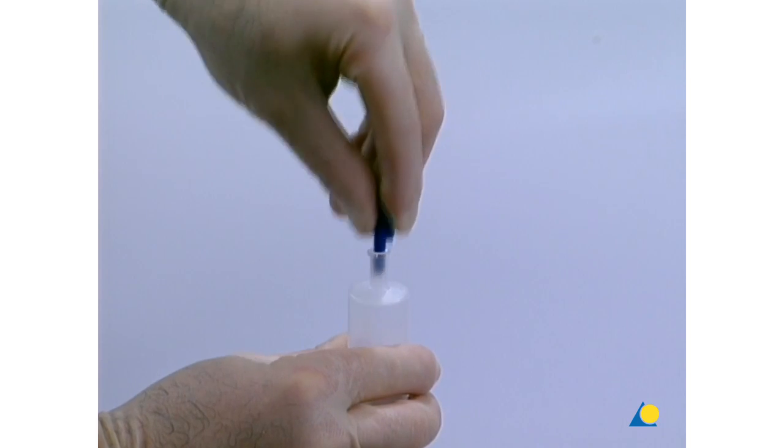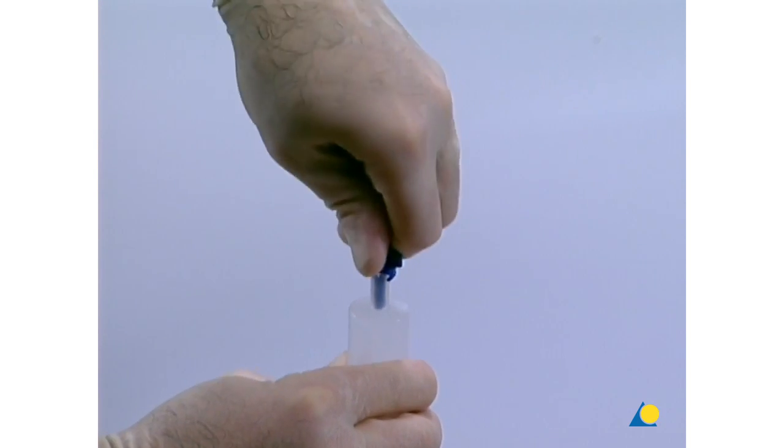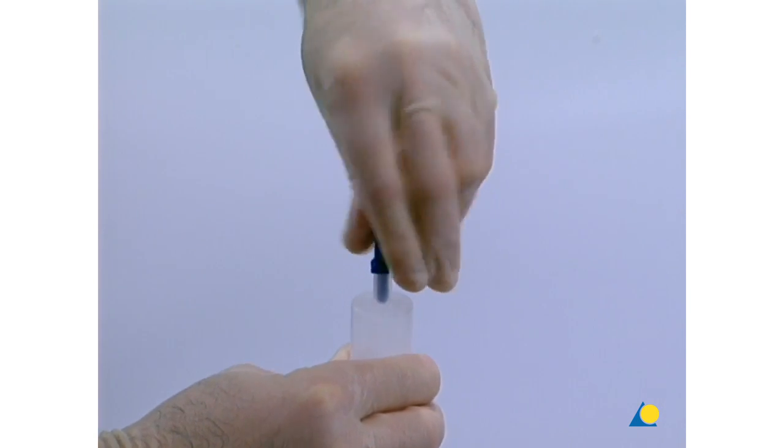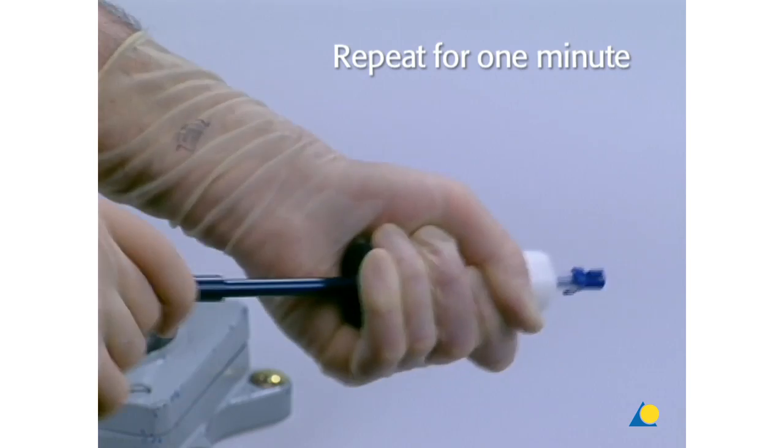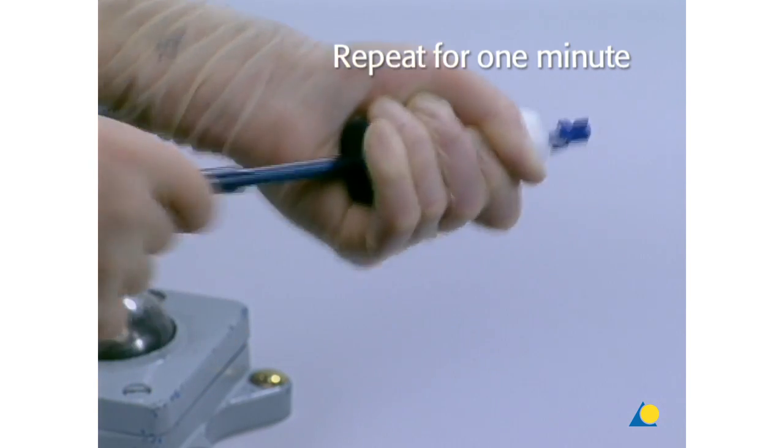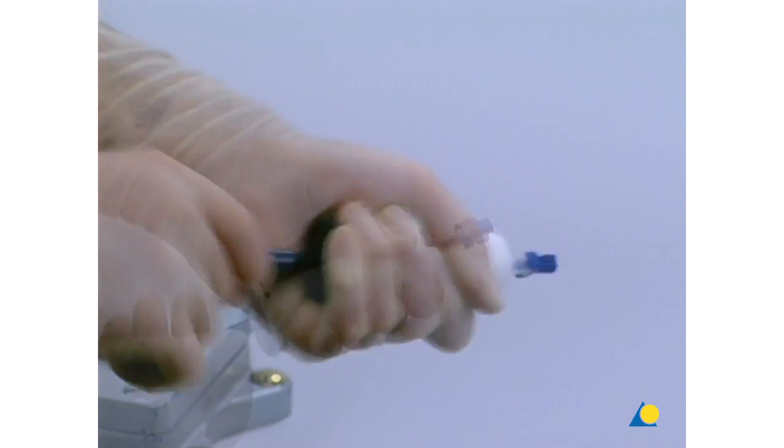The blue sealing cap is replaced and locked by its bayonet catch. The Kronos inject is mixed by moving the blue plunger back and forth from stop to stop for a full minute. The plunger is rotated at the same time.